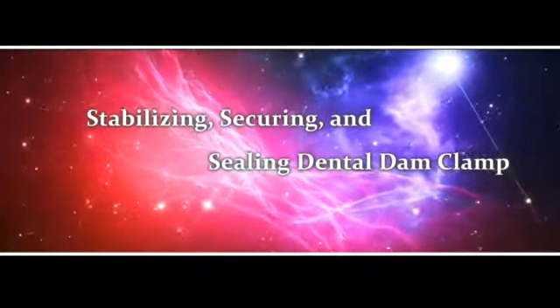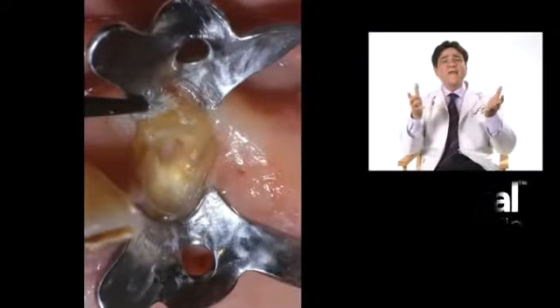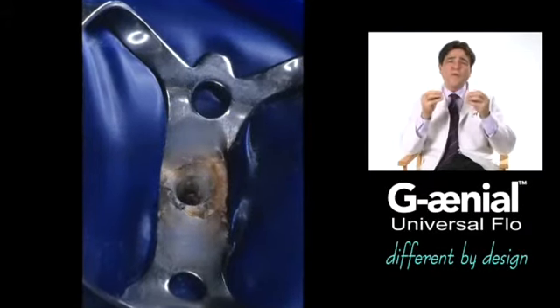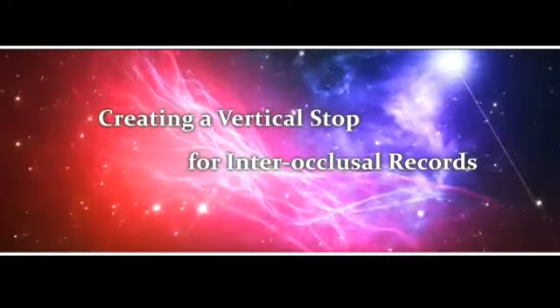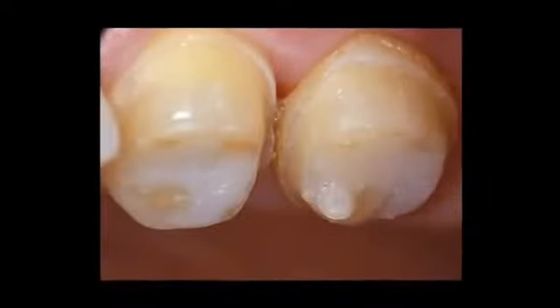Flowables can be used to stabilize, secure, and seal the dental dam clamp prior to procedure. Endodontic and adhesive procedures require proper isolation, and these flowable materials can be used to stabilize, secure, and seal the working field. Creating a vertical stop for inter-occlusal records: flowable composite resin can be used as an accurate inter-occlusal record for the orientation of models for fixed prosthetic restoration.